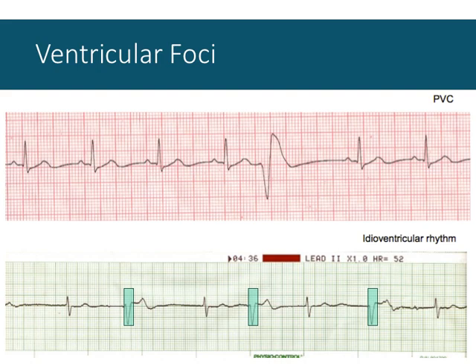Normally the signal is sent through the conduction system of the heart, which is purposefully designed to quickly transmit the signal for contraction. But we start to see a wide QRS complex whenever that signal doesn't go only through the conduction pathway, but spreads through adjacent cells. That often happens if contraction is initiated from foci that are not immediately on the conduction pathway. Walls of the ventricles, for instance, might initiate these cell-to-cell depolarizations.